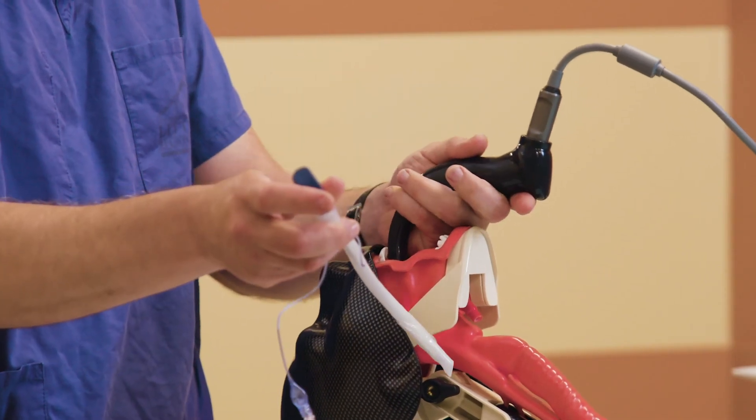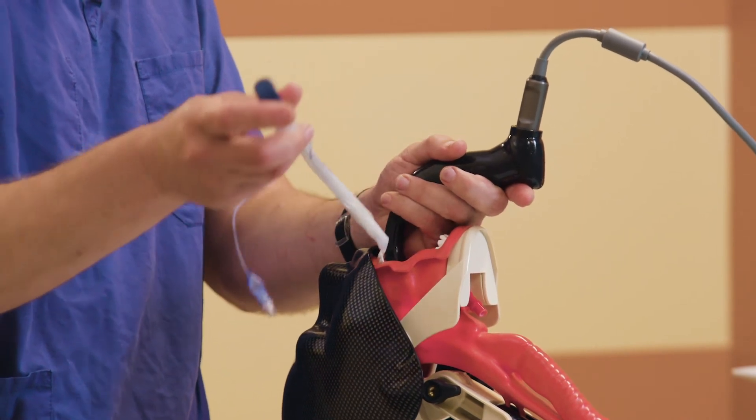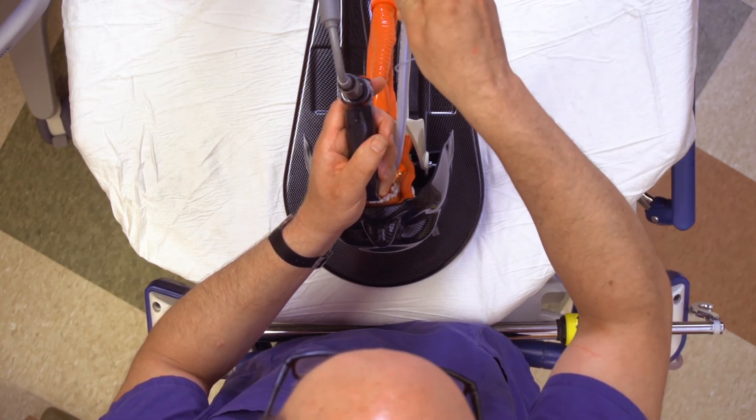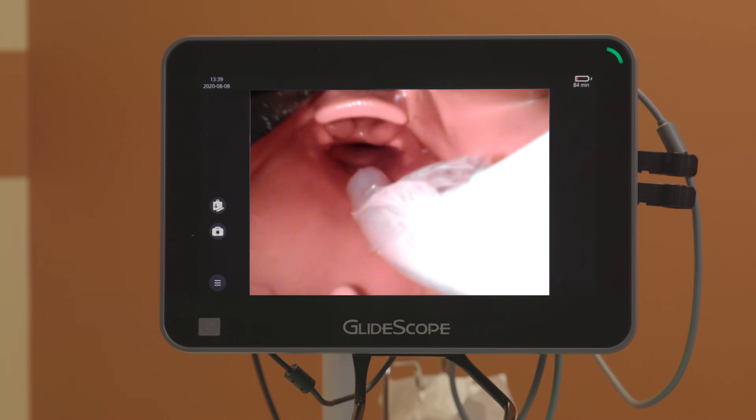As I pick up our hyper-angulated stylet, I want to be conscious about watching the insertion of the stylet under direct vision into the mouth until it becomes visible on the screen.